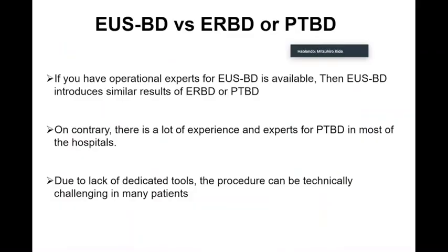So this is the summary. If an optimal expert for EUS-BD is available, then EUS-BD gives similar results to ERBD or PTBD. On the contrary, there is a lot of experience and expertise for PTBD in most hospitals, so that is also true. Due to the lack of dedicated tools, the procedure can be technically challenging in many patients.